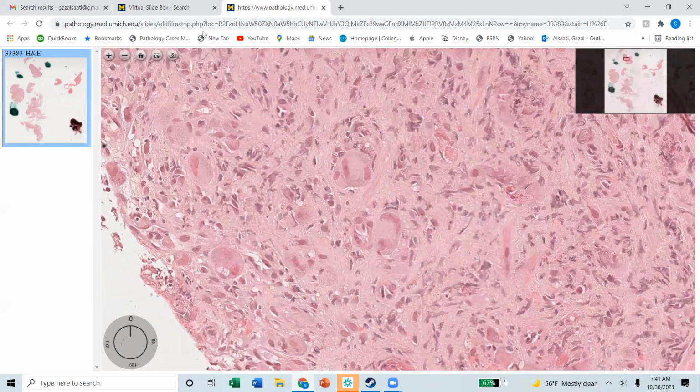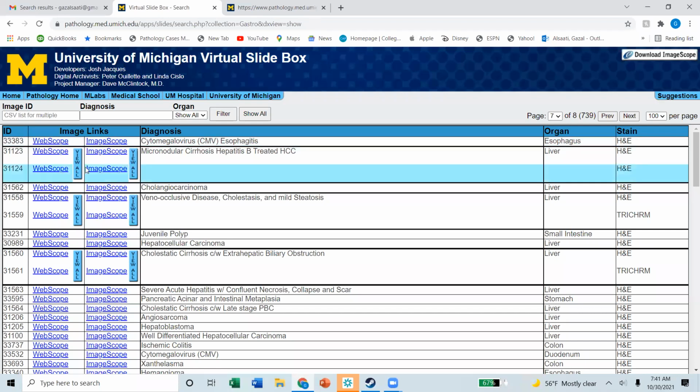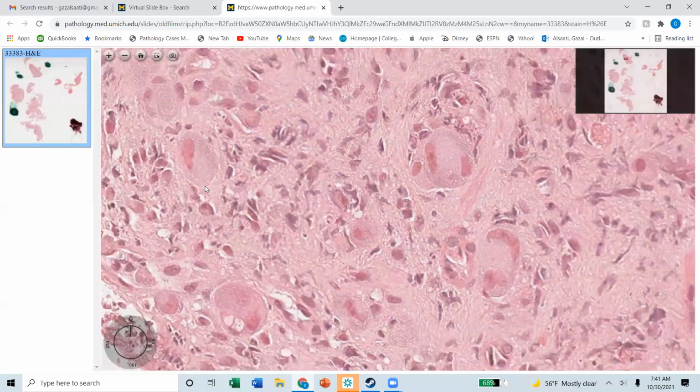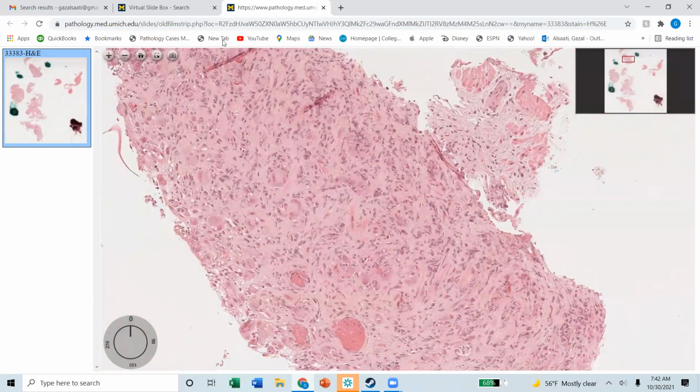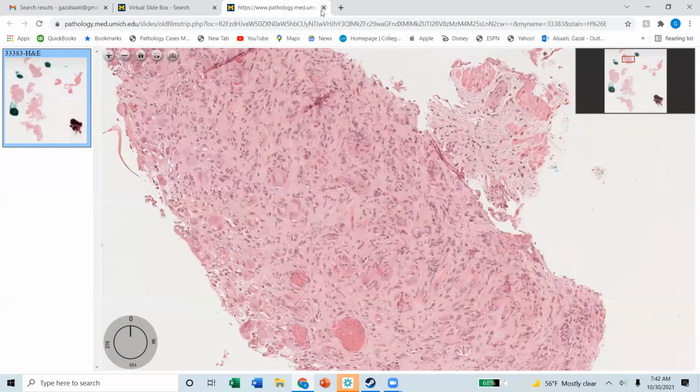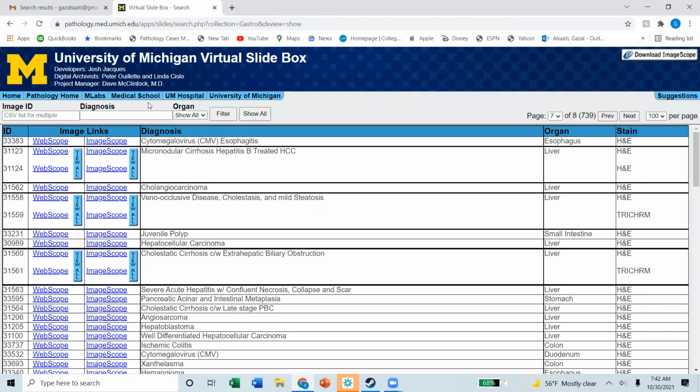Okay, let's look at the stain. Oh, no? Oh, okay. Well, they didn't even do the stain, maybe. Exactly. All right, so now we have, well, definitely I would do immunostains on this. I will do a herpes. Yeah, everything. I'll just do all my bug stains, but yeah, they call it CMV.